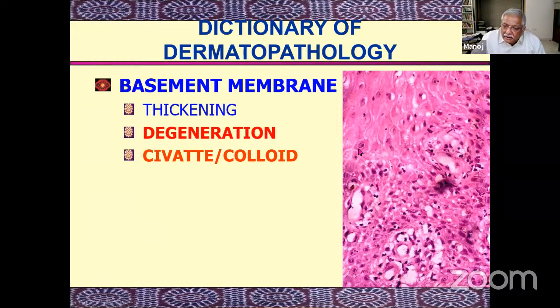It's degenerating here. A halo has formed around the nucleus, which means that the cytokeratin, which was there in the cytoplasm, is becoming into bundles. And this cell, again, you may have one or two cells like this somewhere. Here you have a cell in which the nucleus is breaking apart, but the cytoplasm is okay. And then this roughly is the area of the basement membrane.